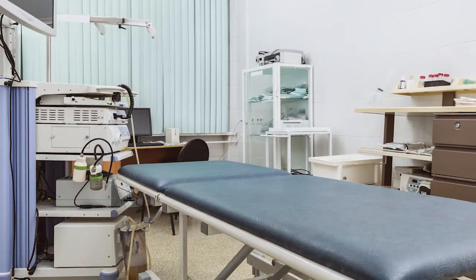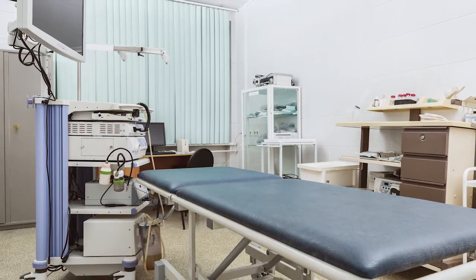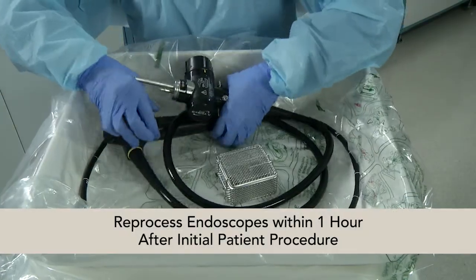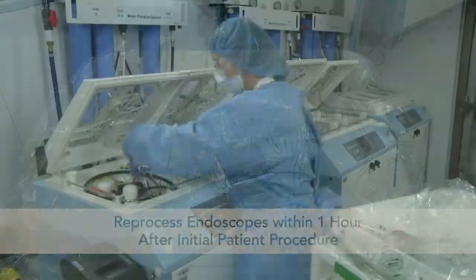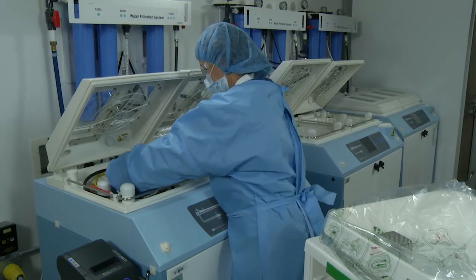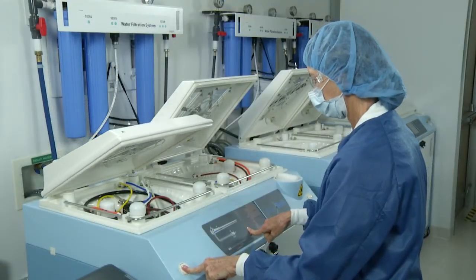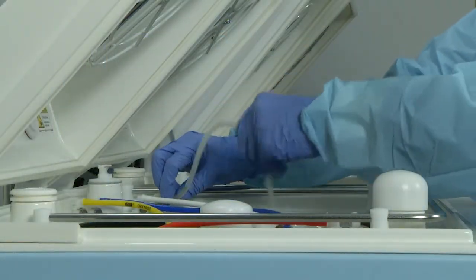Procedure room pre-cleaning should be performed immediately after removal of the insertion tube and within the patient's room. It is recommended that endoscopes be reprocessed within 1 hour after the initial patient procedure. Failure to perform the gross macro bioburden removal associated with a procedure room pre-cleaning may result in inadequate cleaning and disinfection in the reprocessor.